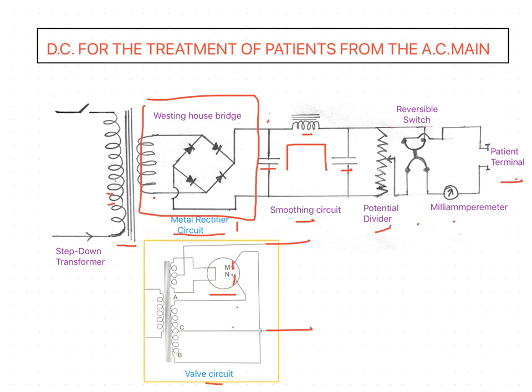You have to use damp pads, which should never be placed on the apparatus, and the operator's hands should be dry when handling the equipment. Okay, and circuits which incorporate valves require about 1 minute to warm up after the current has been turned on. Once the circuit has warmed up, the current should be left on if the apparatus is required again in a short time, as repeated heating and cooling shortens the life of the filament of a valve.